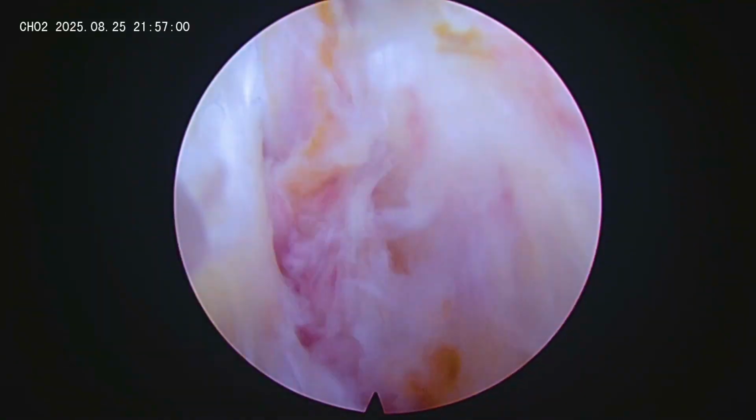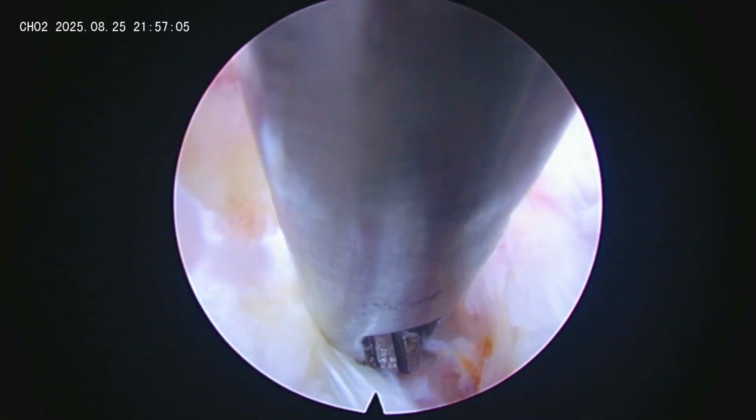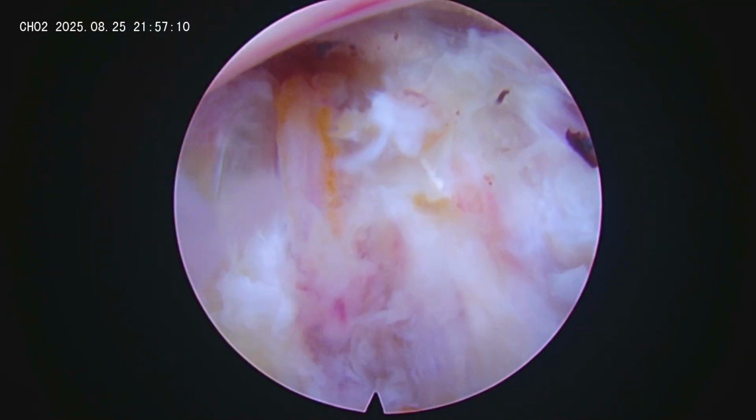Here I exposed the entire length of the annular defect and ablated all the inflammatory tissue lying in the defect.